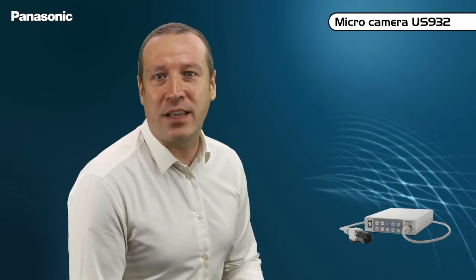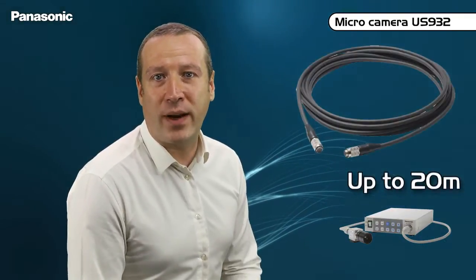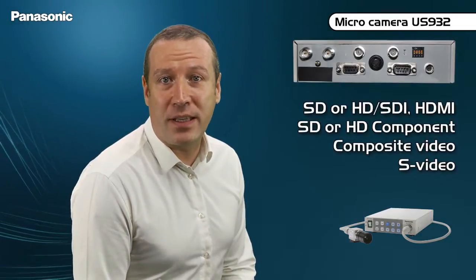The US932 is linked to the US932CS control unit with cables up to 20 meters long. The complete installation has a power consumption as low as 14 Watts. The rear side of the control unit shows a very complete set of connectors.